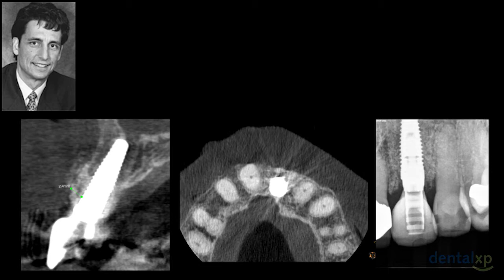Now, the problem is you have to look at what your own individual outcomes are. In other words, I've been monitoring my results with CT scanners and making sure that I do have that buccal bone and that I do have good long-term stability. If you don't routinely do immediate implants, the best solution is do a delayed. If you're going to push the envelope doing immediate implants, you must evaluate your results, not just two-dimensionally, but three-dimensionally.